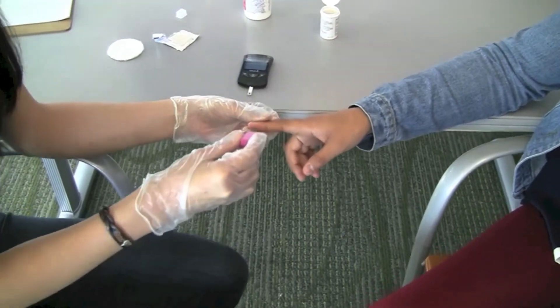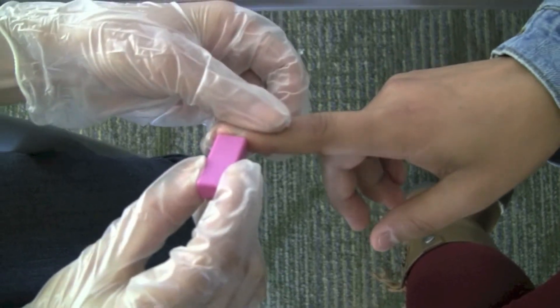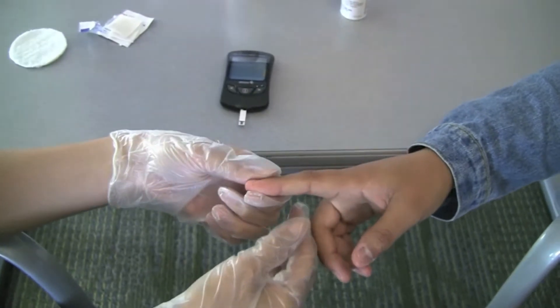Place the lancet on the tip of the finger and press the lancet down to draw blood. If blood does not come out, try again on another finger. Place the lancet in the sharps container.